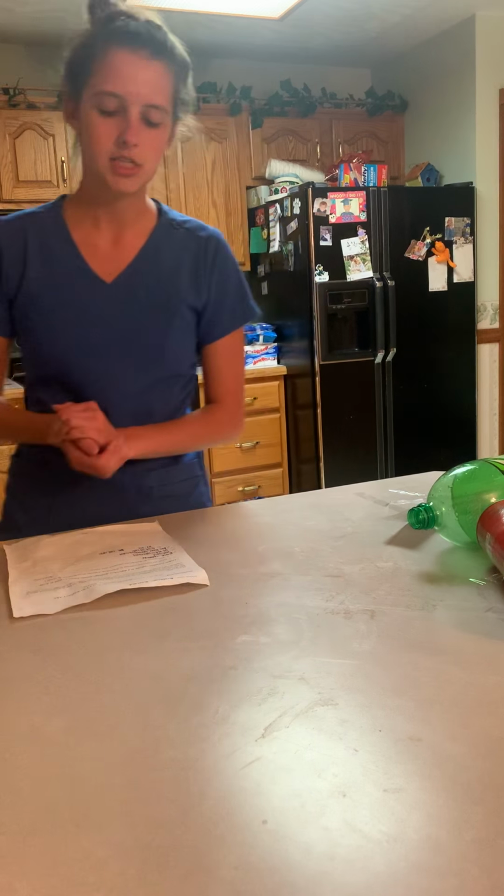So first, I'm going to explain the procedure. So today we're going to be inserting a retention catheter to the dependent drainage. Is that okay with you? And he says yes, so therefore it's okay to go on. Okay, can you tell me where you are? And he says the UK College of Nursing building. Can you tell me what day it is? And he says Tuesday. Can you tell me what month is coming up next? And he says April. So the patient is alert and oriented times 3. And are you allergic to betadine or latex? And he says no. So therefore it's okay to go on.